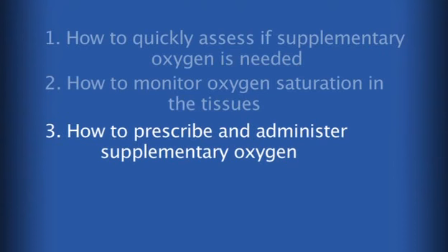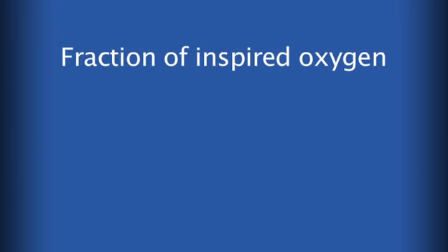How to prescribe oxygen using the different devices and oxygen flow rates that are available. This section will describe how to correct hypoxemia more effectively by using different devices and oxygen flow rates, and it will give you an approximate indication of the different concentrations of oxygen that they provide. This percentage concentration of oxygen given to patients is called the fraction of inspired oxygen, or FiO2.